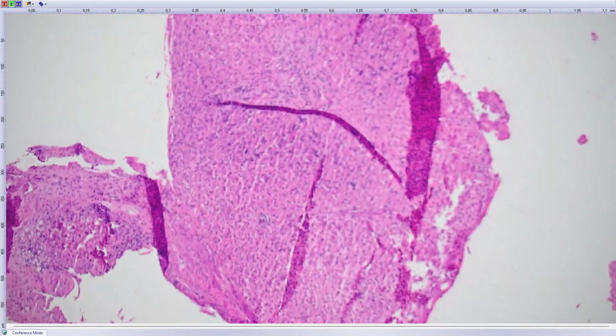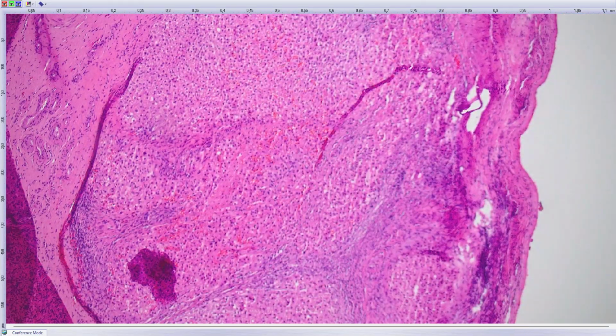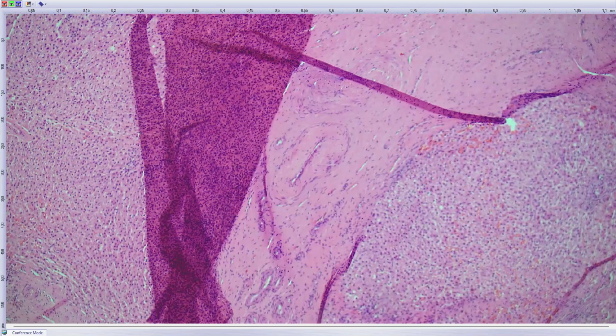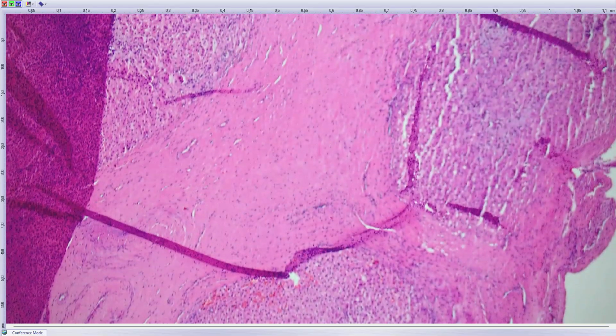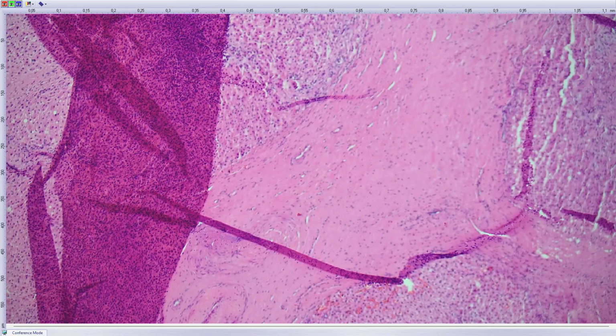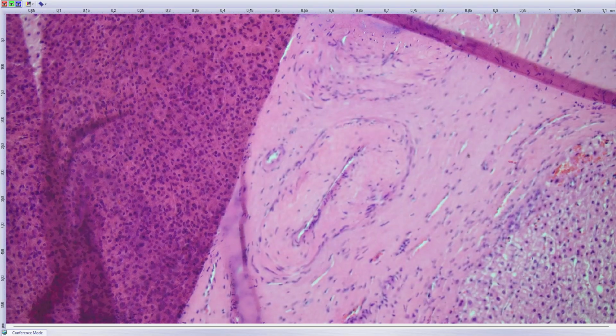And this is quite a frequent diagnosis, and it is characterized by the nodular appearance of otherwise normal, or at least structurally normal, sinusoids of the hepatocytes, and there are intersecting thick fibrous septae, very typically containing these thick walled arteries, like here.